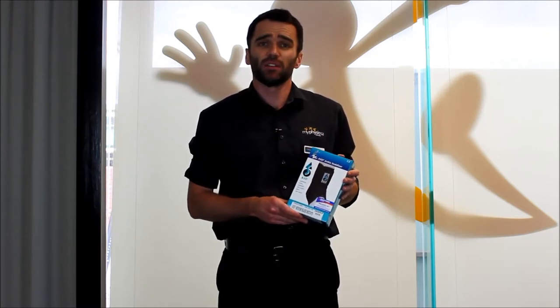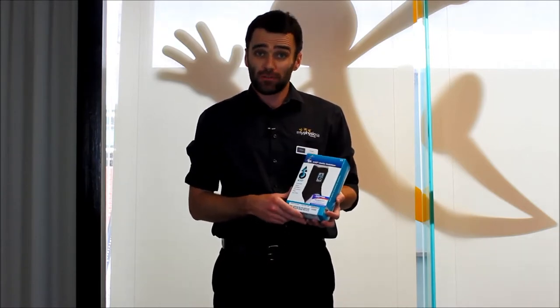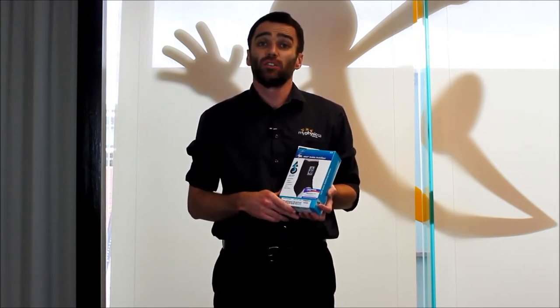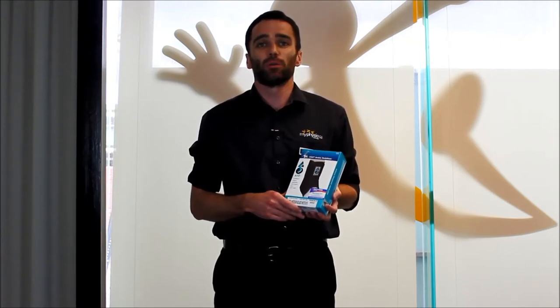It's particularly snug and supportive and we get great feedback with regards to its comfort when you're on the court or on the sports field. If you're after an ankle brace, we stock these here at MyPhysioSA. You don't need to make an appointment to come in and try one on — our friendly staff will be more than happy to help you out with the correct fitting.